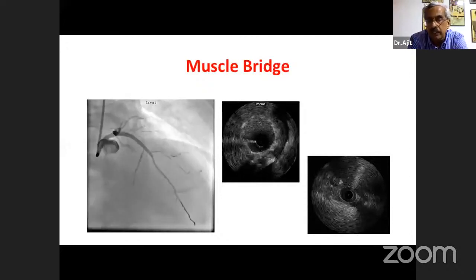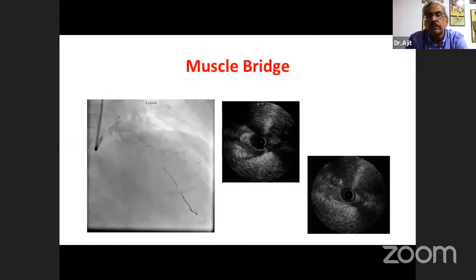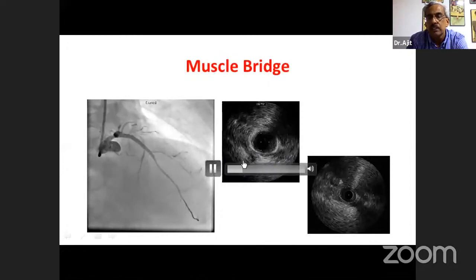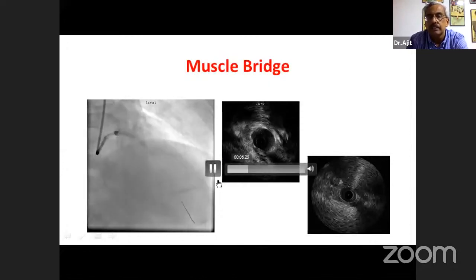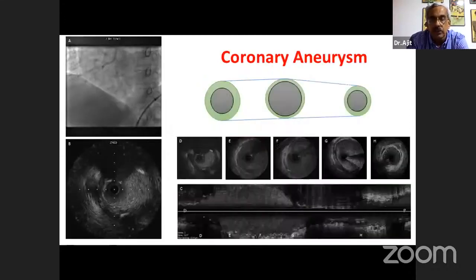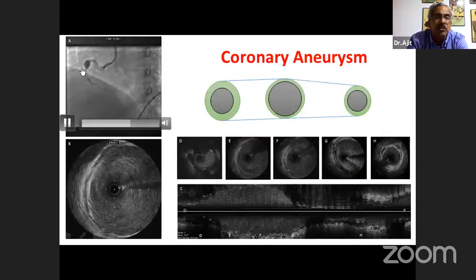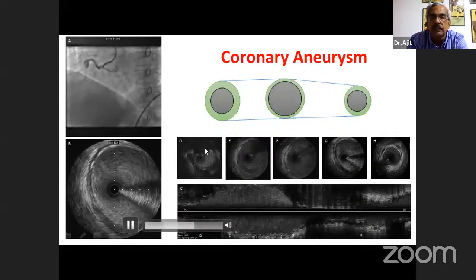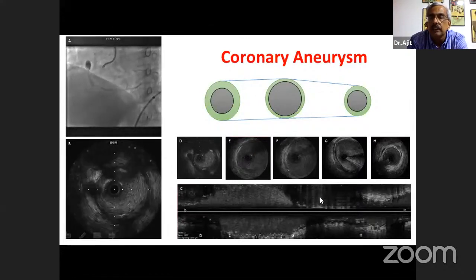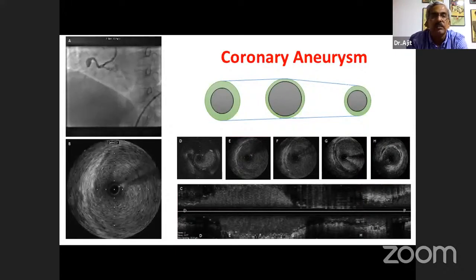Here's a patient who had a stent very precisely placed just before the myocardial bridge, so that we can be very clear that the bridge is there, you can see the bridge nicely squeezing the coronary and the stent starts there. So we can make decisions about stenting outside the bridge. So here's an angiogram which shows an aneurysm, and again on IVUS you can see the pocket of the aneurysm very clearly. A huge aneurysm which you can see in this picture on the intravascular ultrasound.